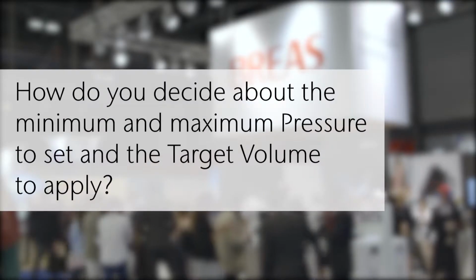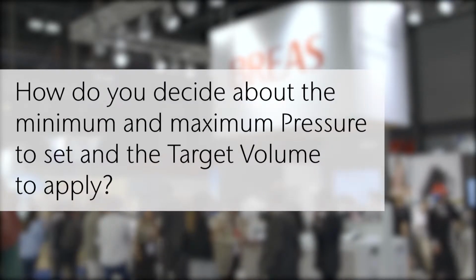Some patients, like COPD patients, need high pressures, and many times they don't tolerate that. So you could use target volume to achieve these high pressures in sleep or in some positions, and it is more effective even if they don't have restrictive components. I usually choose pressures to assure a target volume between 8 and 10 milliliters per kilogram of predicted body weight.